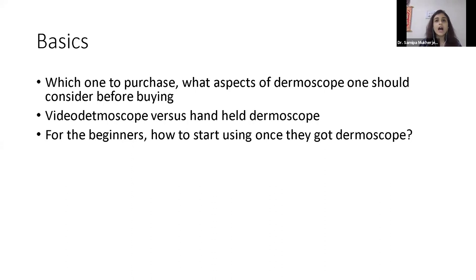Third thing is, how should you focus so that you get your images, and how should you capture them? I always move from the non-polarized mode to the polarized mode, no matter what the lesion is. I capture images in both non-polarized and polarized modes, and I also capture images with the use of a contact fluid. If we are going to use contact fluid, I generally prefer the clear, colorless ultrasound gel most of the time.